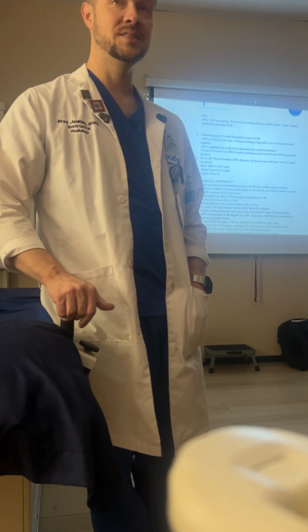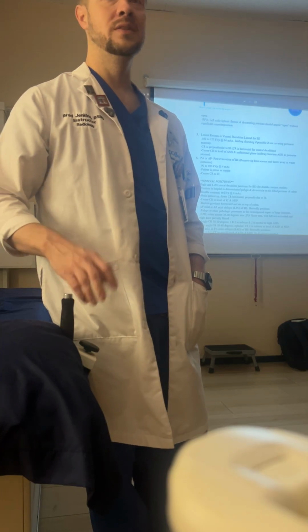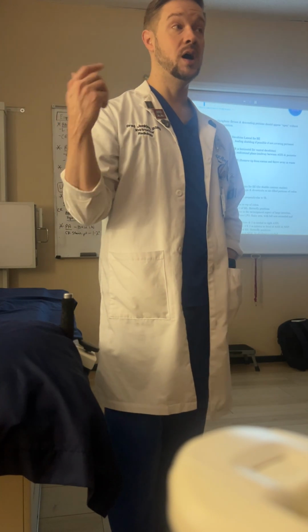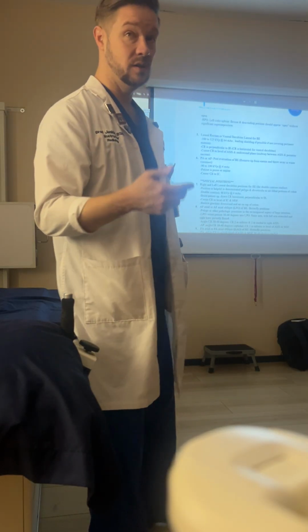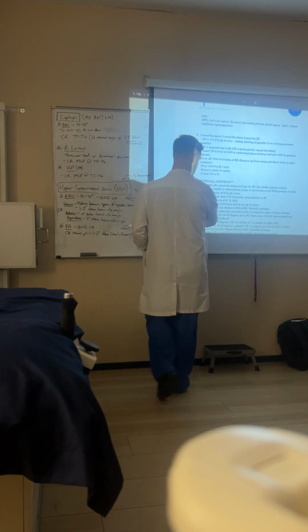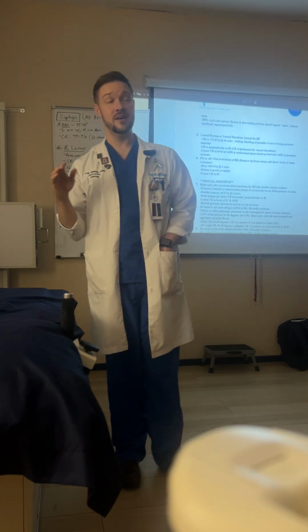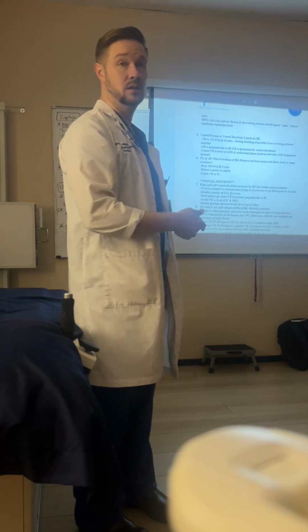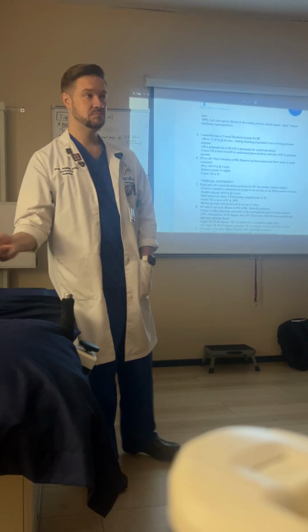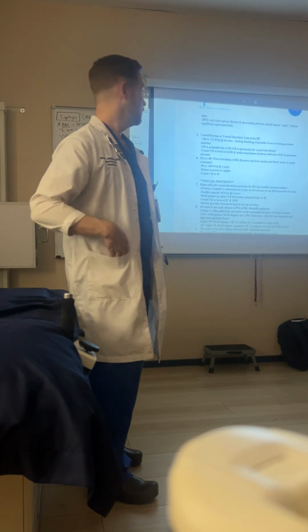So for your practicing, you're going to be focusing on the exams that will be on your final. The rest of the exams that are on this list, you should know, because there's a possibility that it could be in your clinical environment. Especially a lateral rectum. They do that one a lot. Oftentimes radiologists will begin their fluoroscopy by looking at the lateral rectum, just because they want to see the initial filling and make sure that the tip is in the right place.